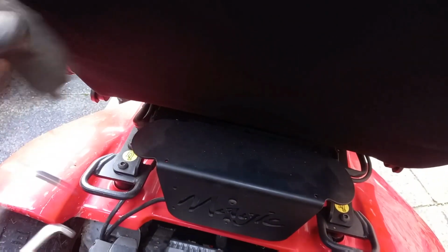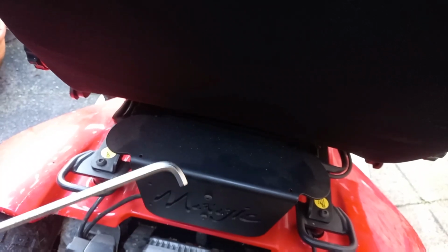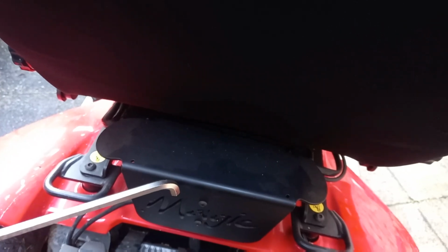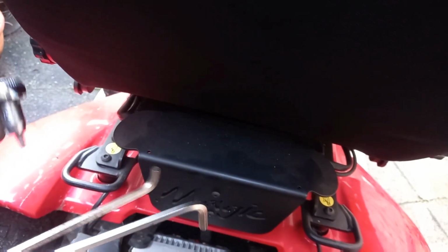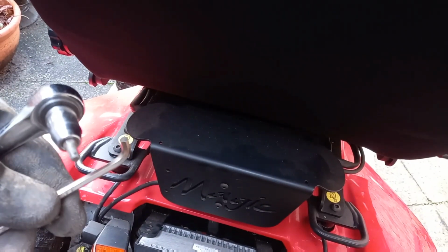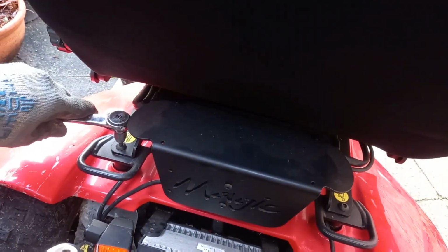You know. So luckily I'd got one of them that was ground down, because I used it on motorcycle carburetors, intake stubs and things like that. I've had hundreds, thousands of motorbikes over the years, so that was cut down ready, so I can use that on the front ones and this one on the back ones to make it easy, you see.